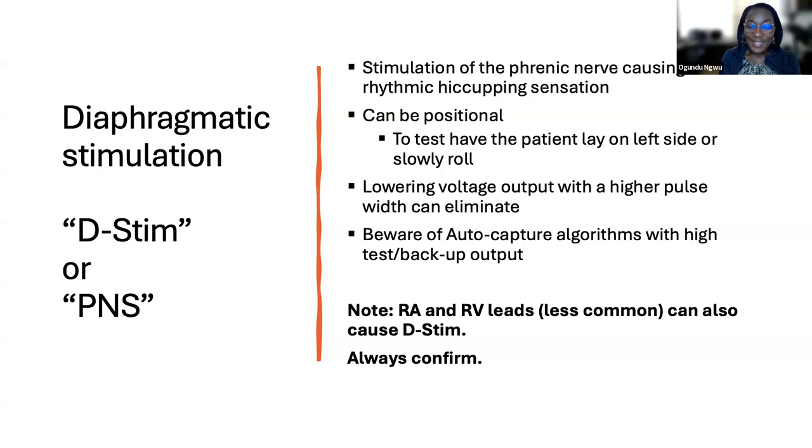And don't forget, as was mentioned, if you're doing your cases under general anesthesia, which I don't usually do, if you have patients who are under GA, please make sure that you ask the anesthesiologist to make sure they're not paralyzed, because if they have a paralytic, then you're not going to be able to demonstrate it. And that can be very painful when they go to the holding area and then their whole chest is jumping and then you have to go back into the lab.